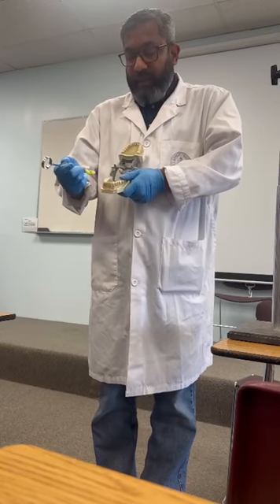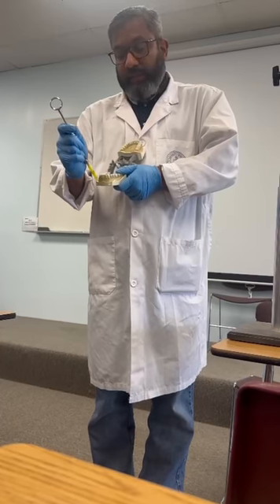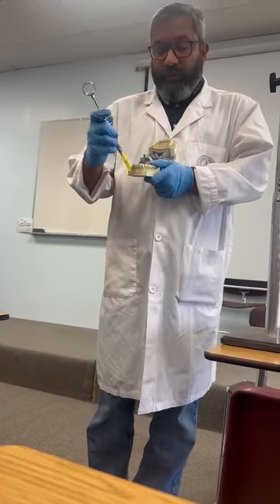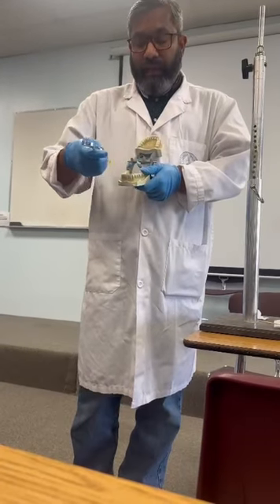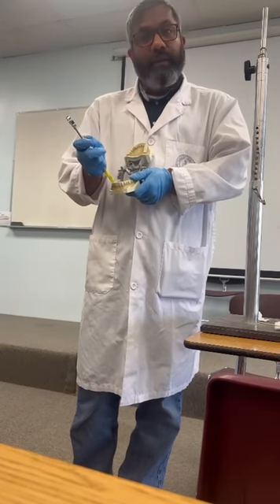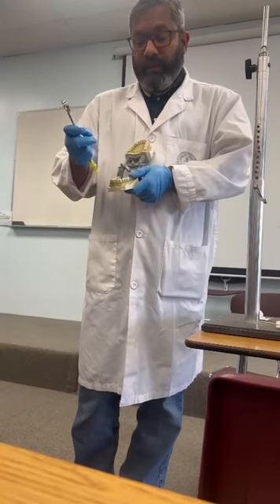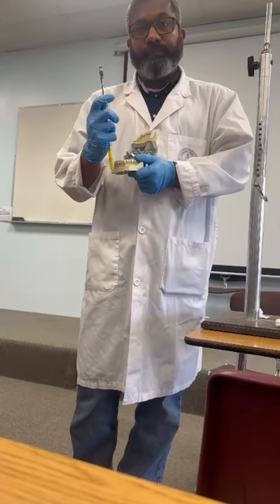For the buccal side, we give the buccal nerve injection, and we give the incisive block injection. First we give one injection here, the inferior alveolar nerve block, and if the dentist works on the posterior teeth, they will go for the buccal nerve block. If the dentist wants the anterior teeth, they will go for the incisive nerve block, in between the premolars.